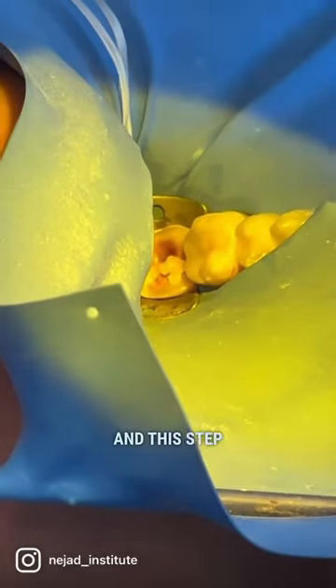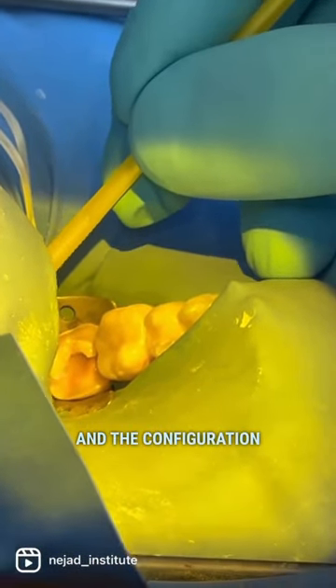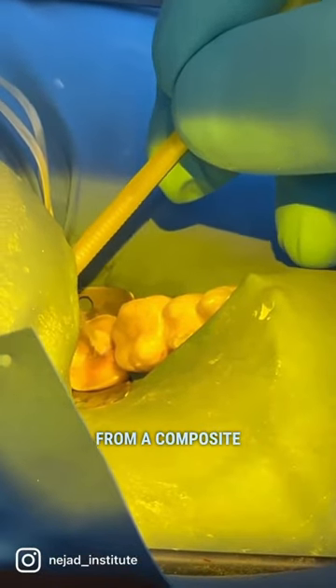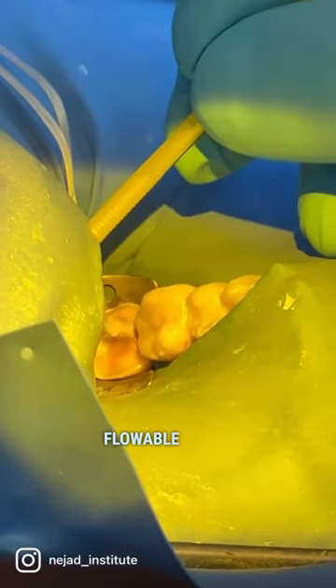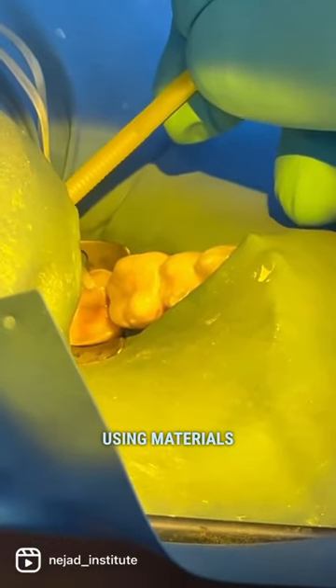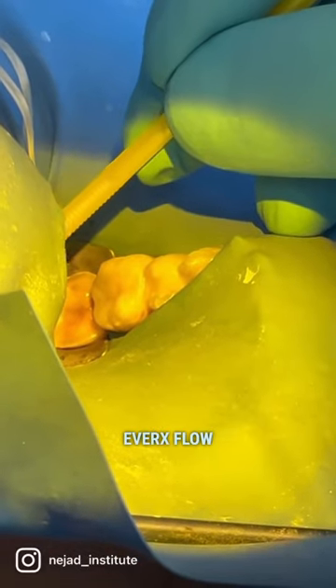After immediate dentin sealing comes the restorative foundation, and this step is really important and varies depending on the preparation, the configuration, and what you're trying to accomplish. It can be anything from a composite buildup to a flowable lining called resin coating, or even a buildup using materials that have fiber reinforcement in them, such as EverX and EverX Flow.